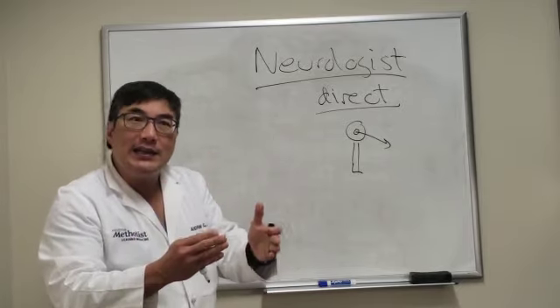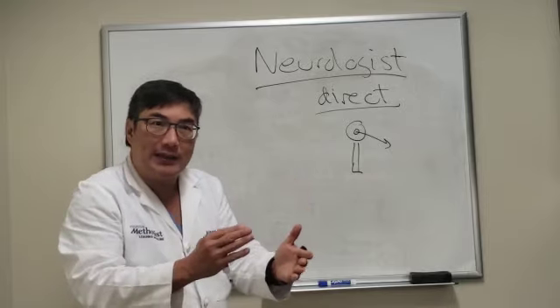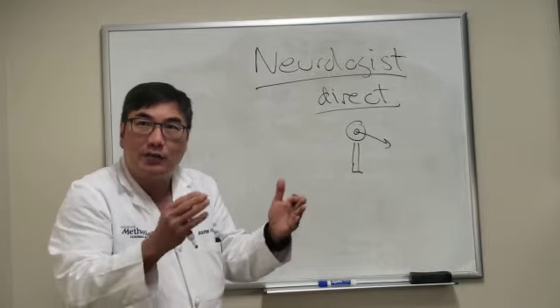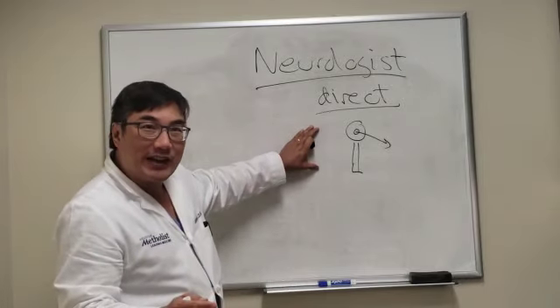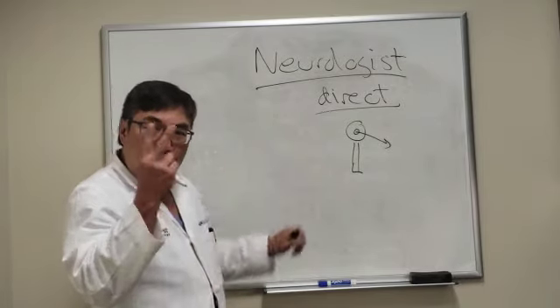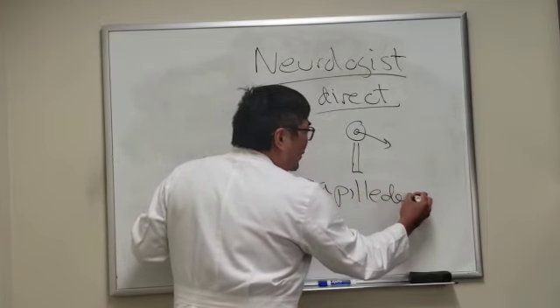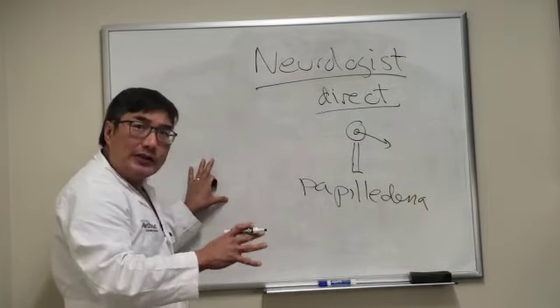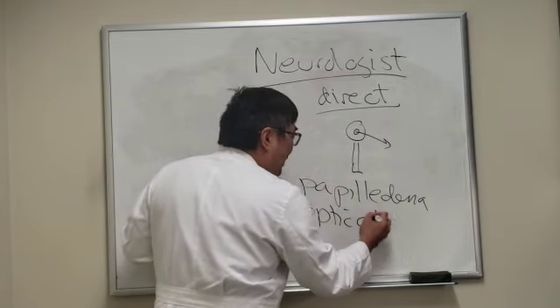And that's really the main thing. You're not trying to diagnose some diabetic retinopathy or look for hemorrhages in the periphery or a retinal detachment. You really are only using the direct to look at the nerve. And there's two ways that you can look and find the brain tumor. The first is papilledema, which is the sign of increase in intracranial pressure, and the second is optic atrophy.